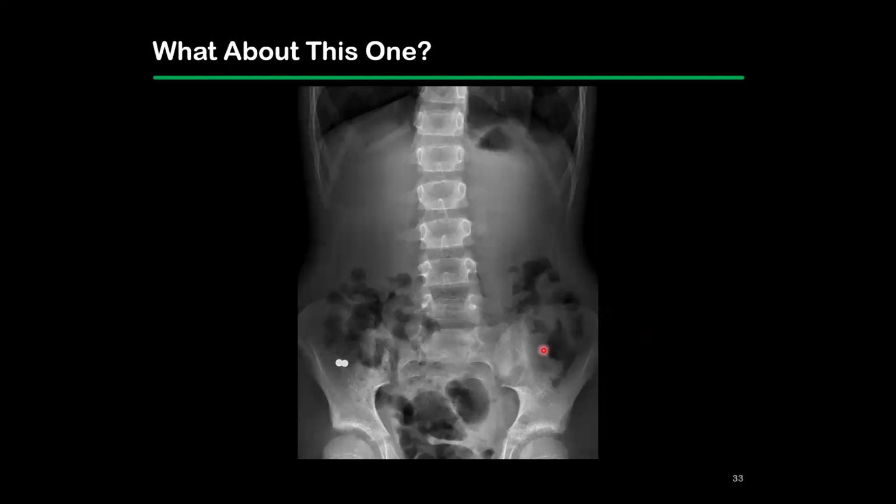This is an abdominal radiograph. And so this person's also ingested a foreign body. Here we see these two radiodense circles that are closely abutting each other. These are rare earth magnets. And these are actually a little bit more of a concern to us because the magnets can potentially get separated and then attract each other over different bowel loops and cause bowel perforations.